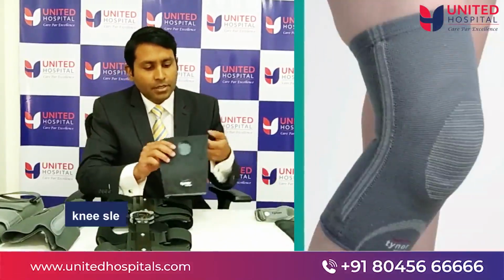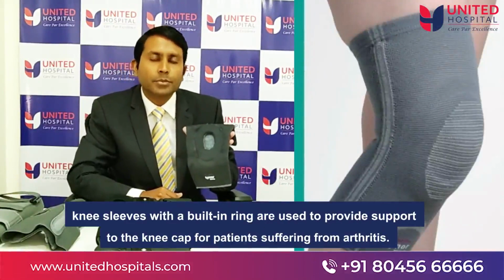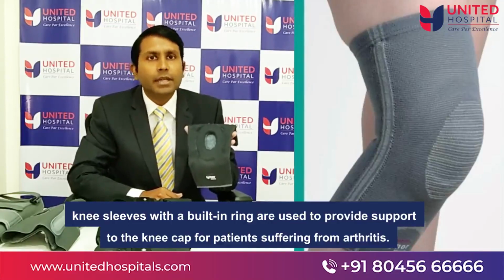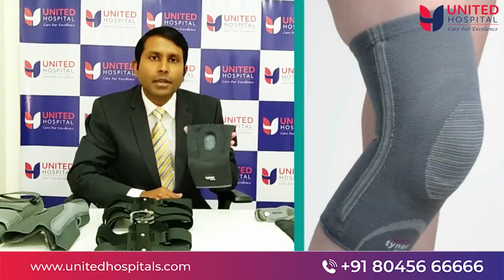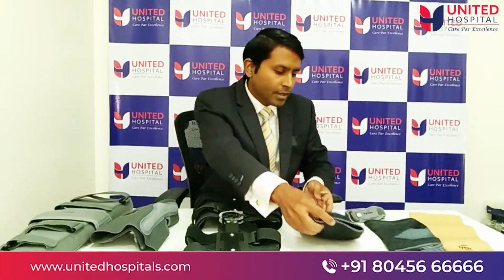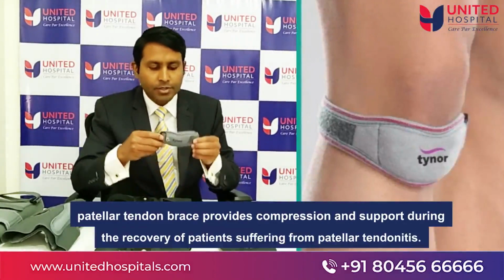Some of these also have a built-in ring for providing support to the patella or the kneecap, and we tend to use these in patients who have kneecap arthritis or wherein the cartilage behind the kneecap tends to thin out, which is referred to as chondromalacia patellae, or also wherein the kneecap joint itself has abnormal shape or morphology, referred to as patellofemoral dysplasia.